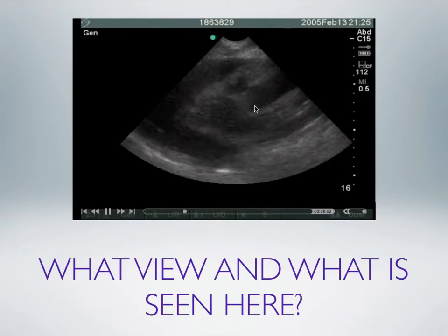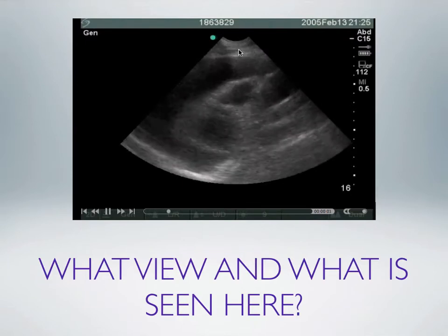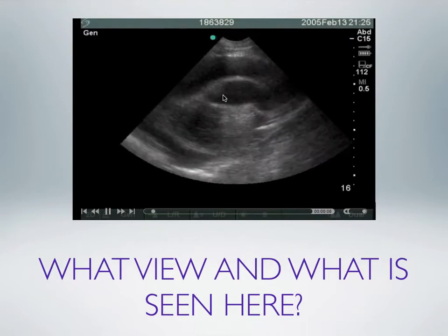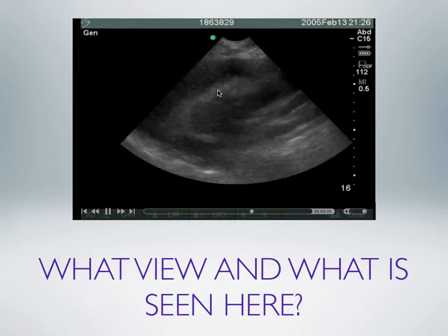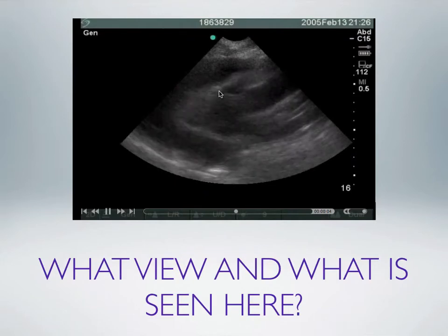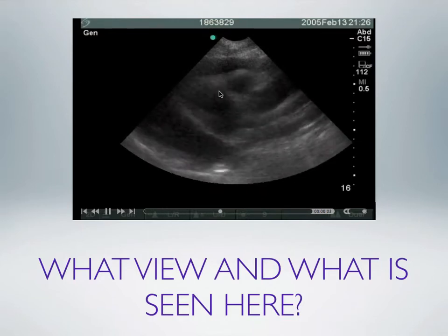Right ventricle is up here. Left atrium, ventricle, aorta over here. Anterior chest up here. And all of this is fluid surrounding this swinging heart. And it looks like someone's jumping up and down on a trampoline at this part of the heart, the right ventricle. So this is somebody who has pericardial tamponade with the heart swinging, electrical alternans, and right ventricular diastolic collapse.